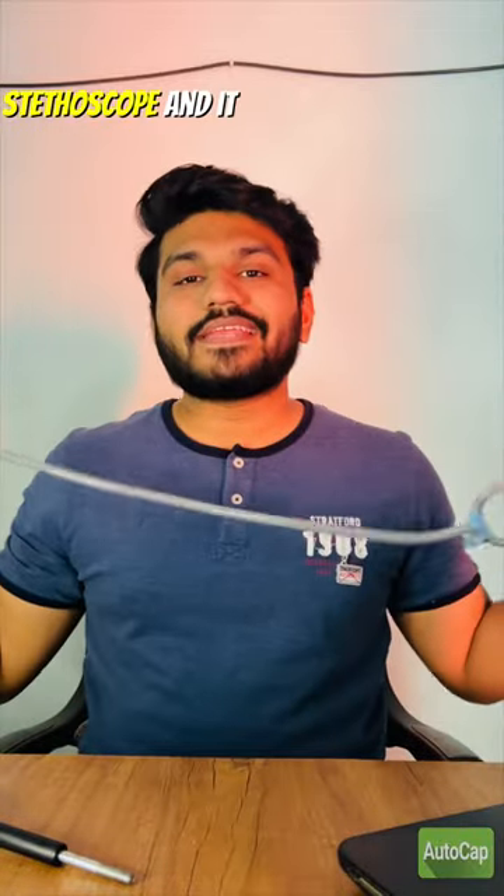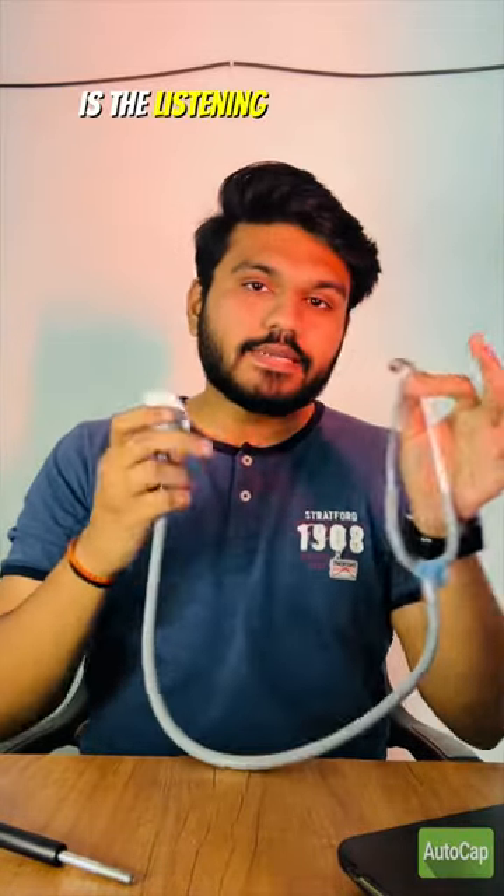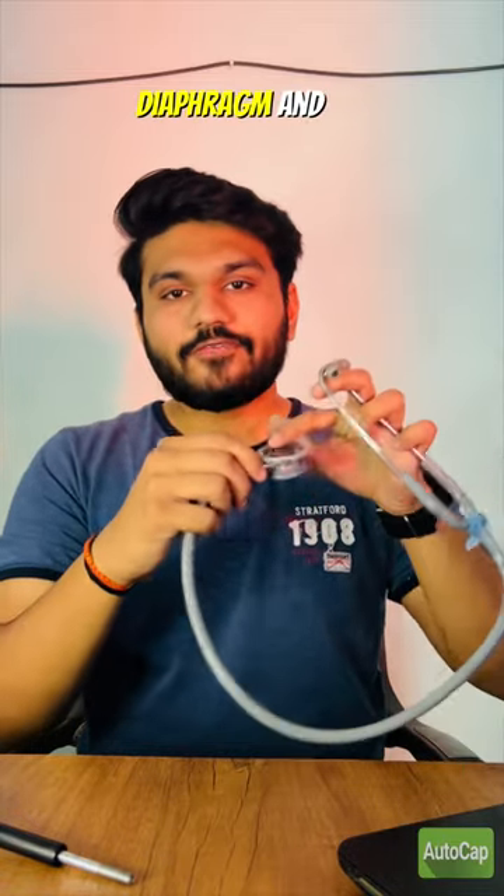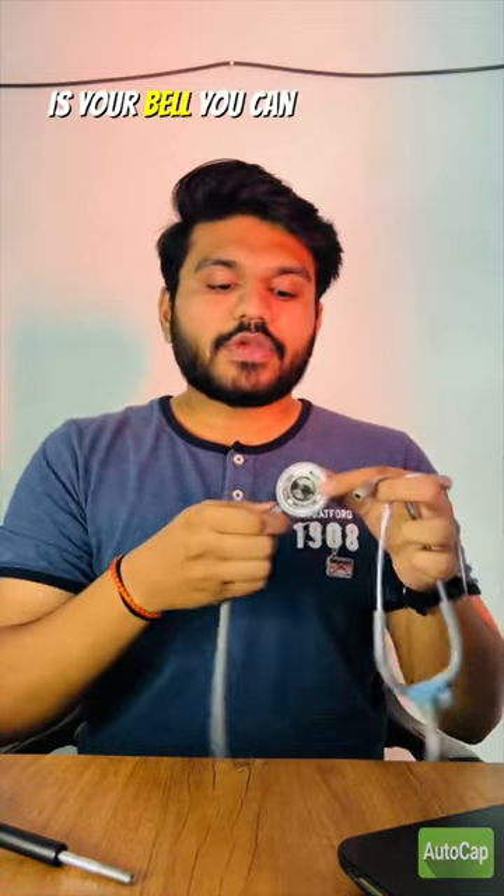This is the stethoscope and it has two parts. This is the listening part and this is the auscultatory part. This is your diaphragm and this is your bell. You can switch it to diaphragm and switch it to bell. In bell, you will hear low pitch sound of the heart, and from the diaphragm, you can hear high pitch sound of the heart and also the peristalsis of the intestine.